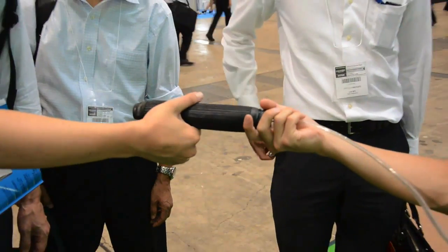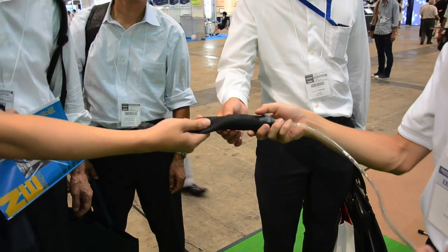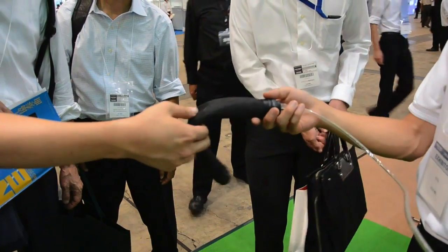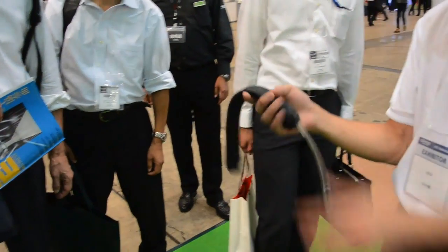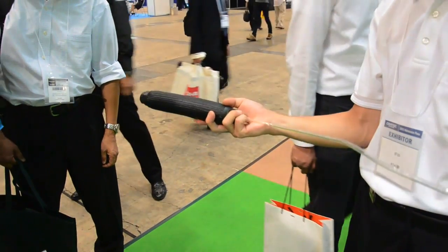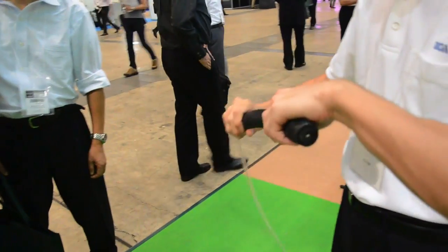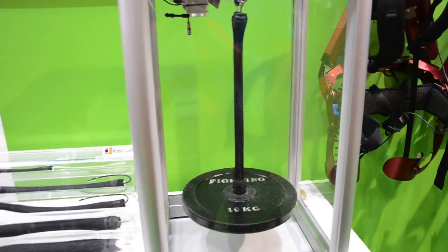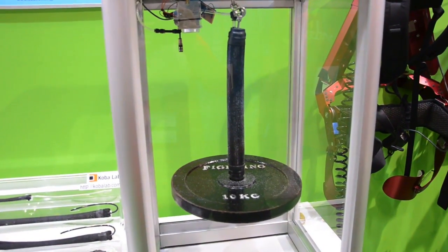This is the artificial muscle that powers the muscle suit. Now it's in floppy mode — it's just air. Once you pump air into it, it contracts and pulls the weight up.